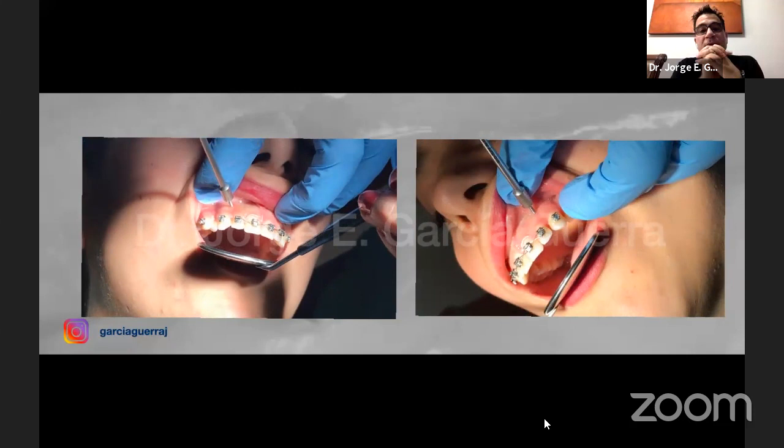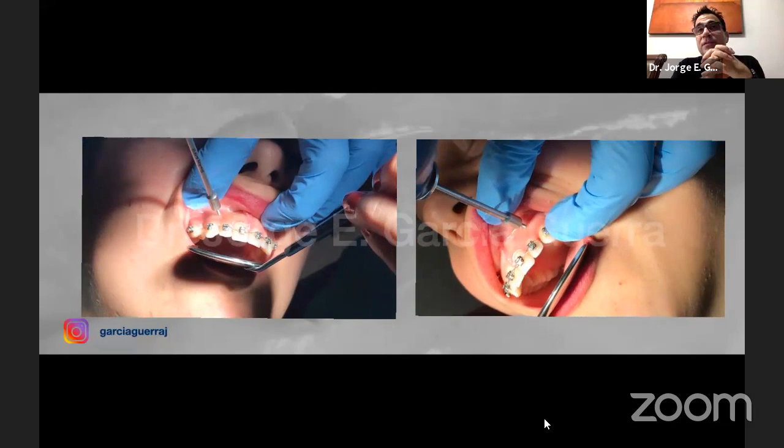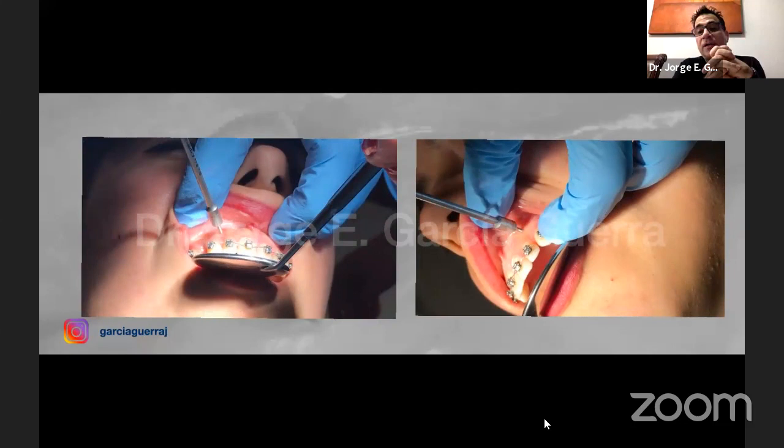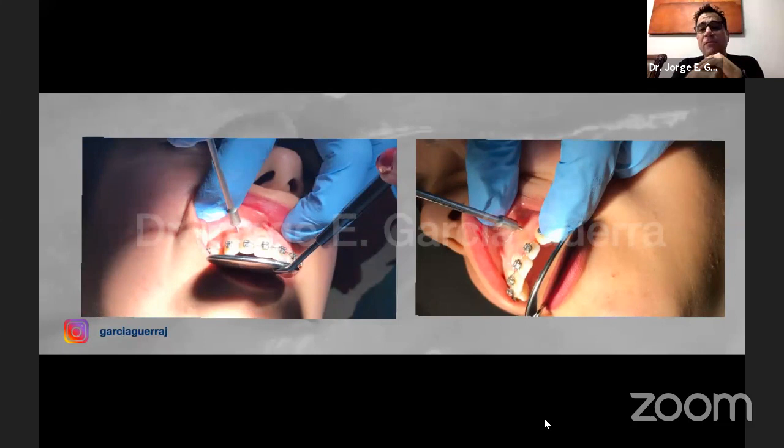Sometimes it depends on the brand of the mini implants. When I use the Ormco brand, they have a 1.4 diameter mini implant. That's also a very good size for using on the anterior part. These mini implants are from Bioray. They have a 1.5 diameter mini implant there.